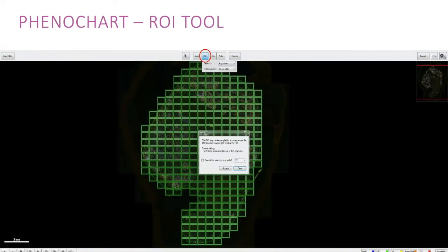On this slide we selected the whole tissue section for multi-spectral imaging and it consisted of 279 MSIs which would have an acquisition time of approximately 140 minutes.